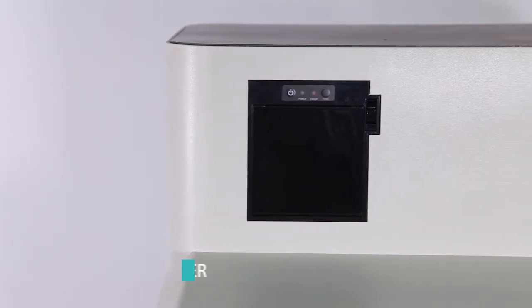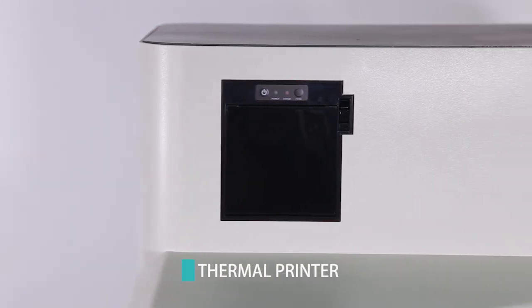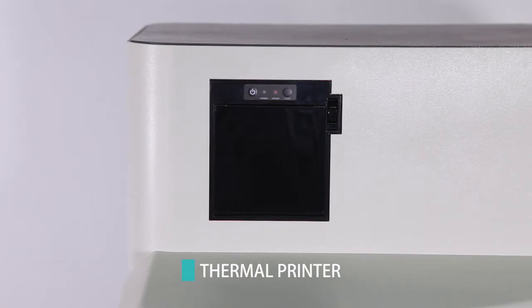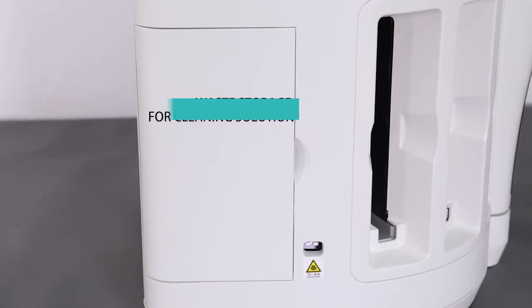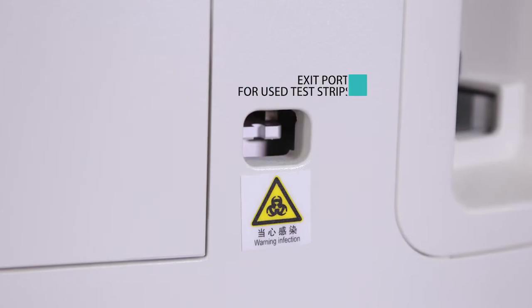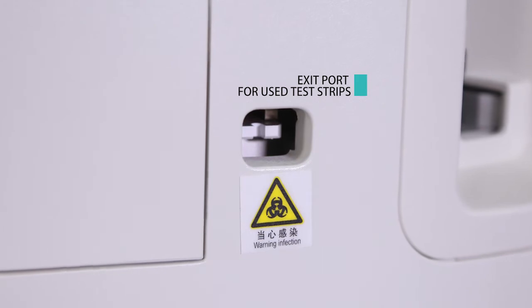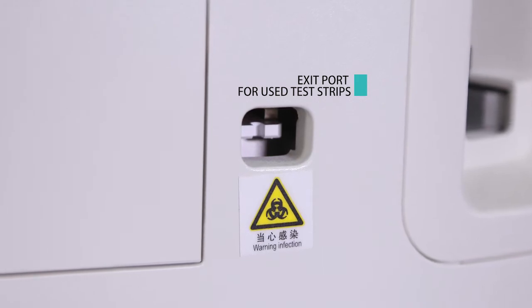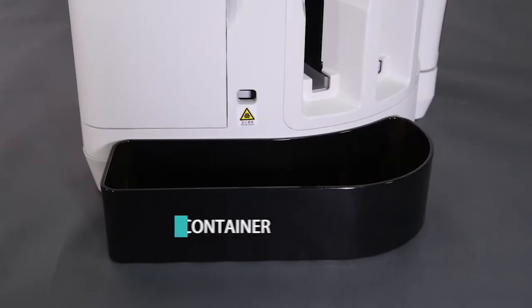On the left side are thermal printer, waste storage for cleaning solution, exit port for used test strips, and waste container.